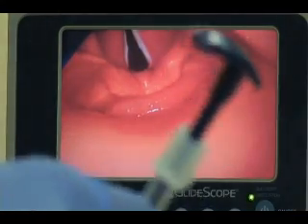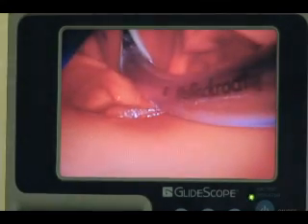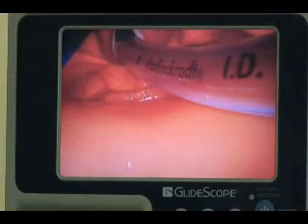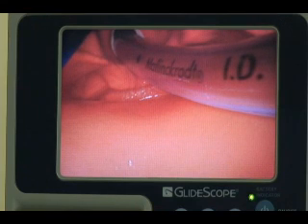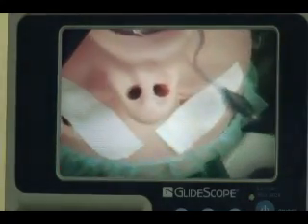You insert the tube. Now, as you insert the tube, remember what I told you about the stylet: if I pull back the stylet, the tube goes up and down. Once you have direct visualization, you take out the stylet. Okay. I'll inflate the balloon. You see. Pull the stylet out. And that's how you use the laryngoscope.